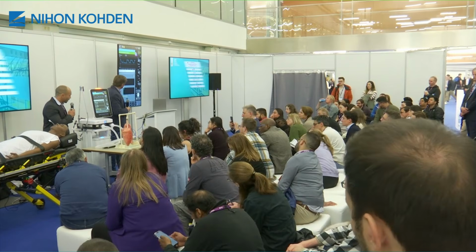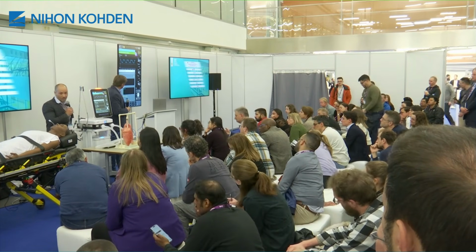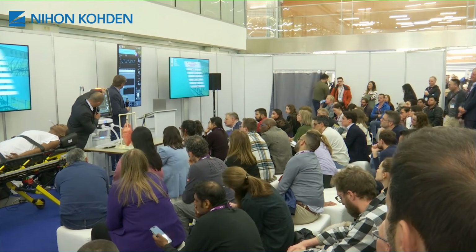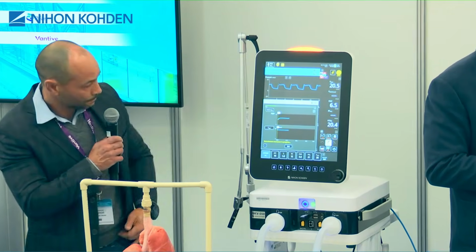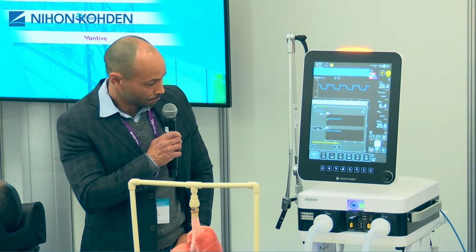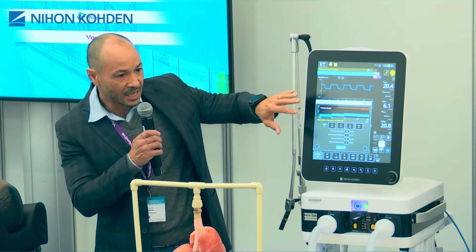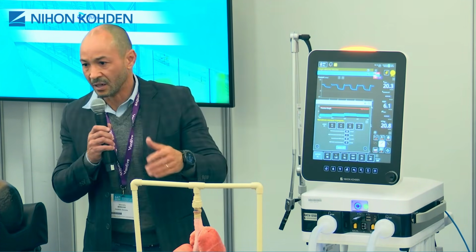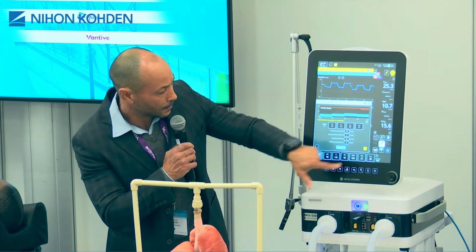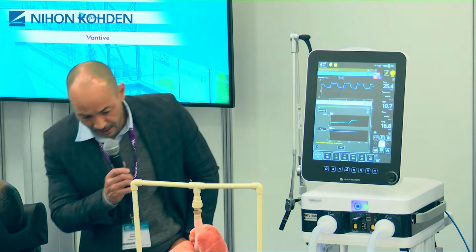I'm doing a gentle maneuver because if I put more pressure, we probably have some issues here. And as you can see, you just need to come in here, set up the settings, and then the ventilator does the maneuver for you.